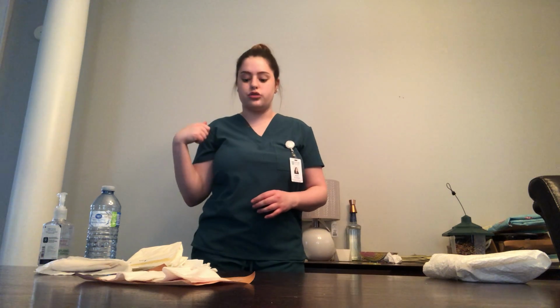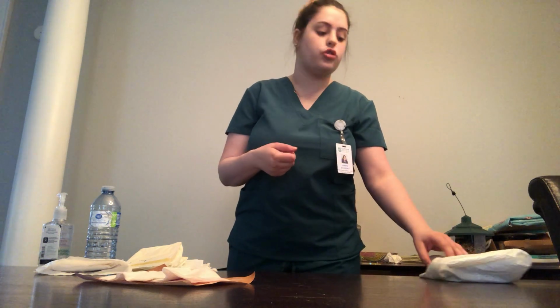So I'm going to do an environmental check. I'm going to make sure that my patient is in the lowest position with all 4 bed brakes on, that the 2 side rails are up, that his call bell is in reach, and that the curtains are drawn and the room is clutter-free. Once all that's done, I'm then going to start. So I'm going to bring my patient up to working height, and I'm going to start opening my sterile tray.